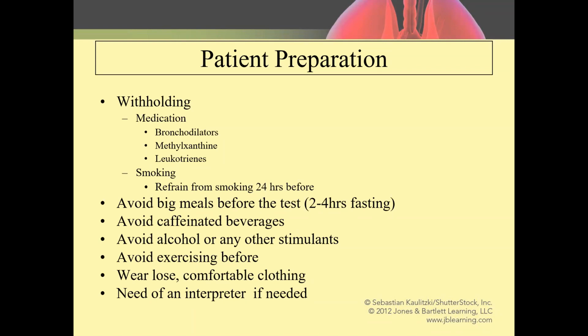Alcohol, avoid exercising beforehand because there are individuals that have exercise-induced bronchoconstriction, and wear comfortable clothing. If they're using some form of interpreting, and when I say some form, I mean some recognized form, whether it be an interpreting phone, your own phone, or some of the hospitals have different colored phones that do the interpretation, or a certified interpreter.